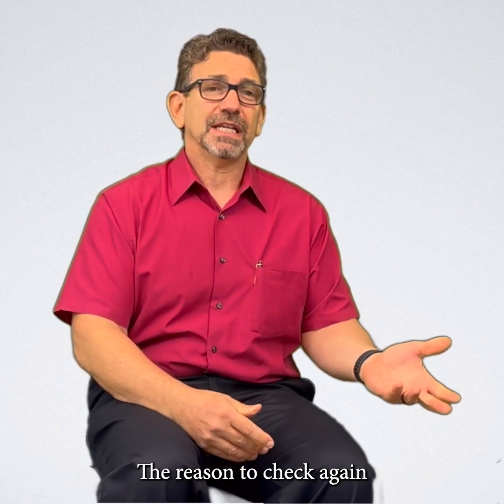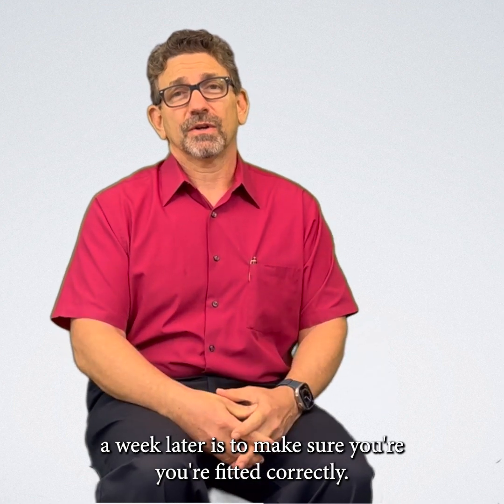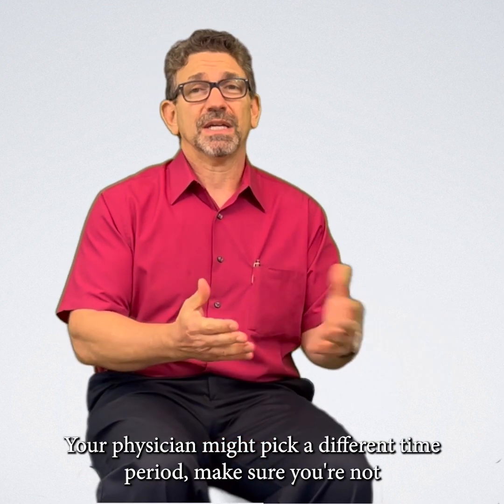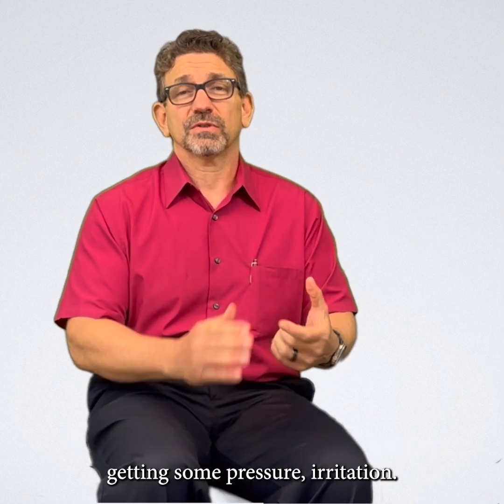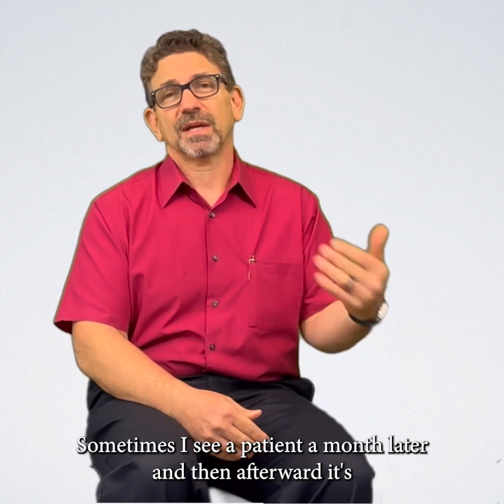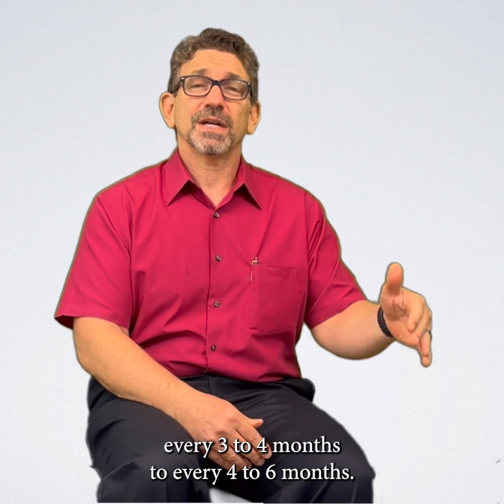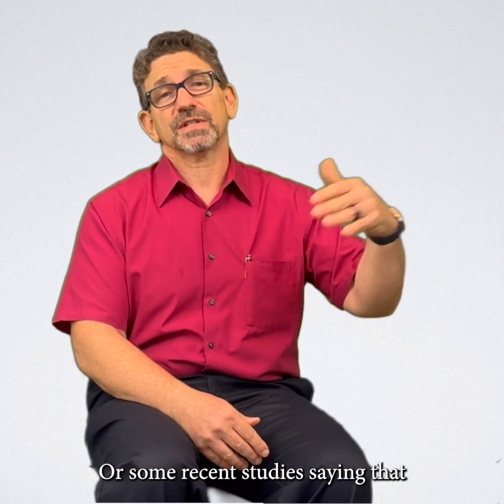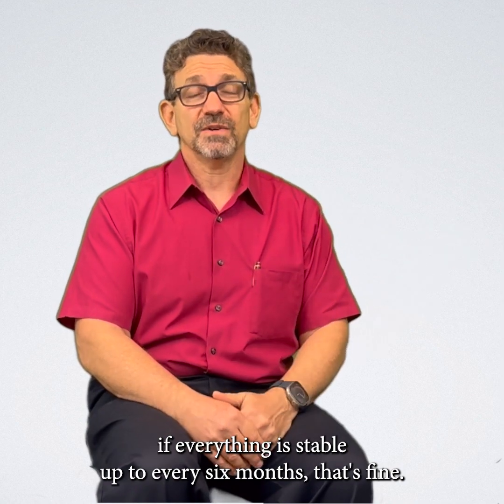The reason to check again a week later is to make sure you're fitted correctly. Your physician might pick a different time period. Make sure you're not getting some pressure or irritation. And then after that, we graduate the time. Sometimes I see a patient a month later, and then afterwards, every 3 to 4 months to every 4 to 6 months, or some recent studies saying that if everything is stable, up to every 6 months is fine.